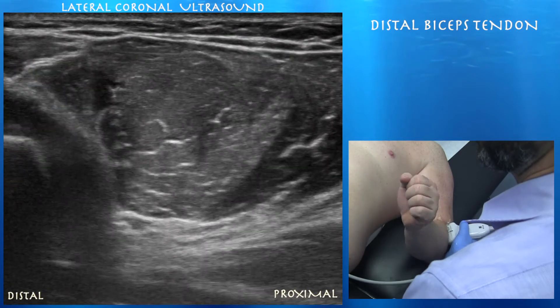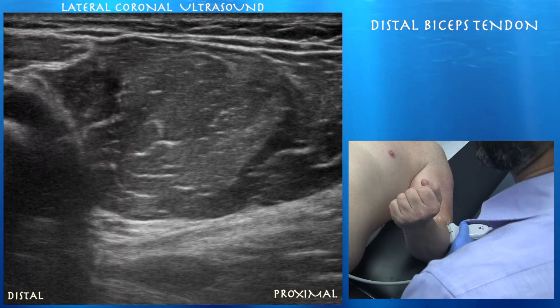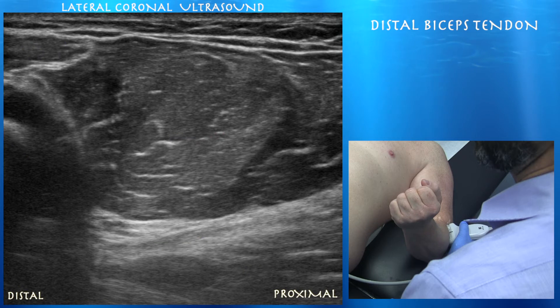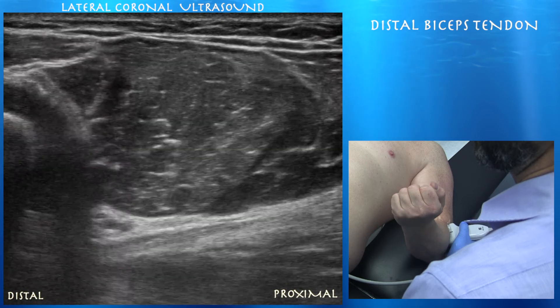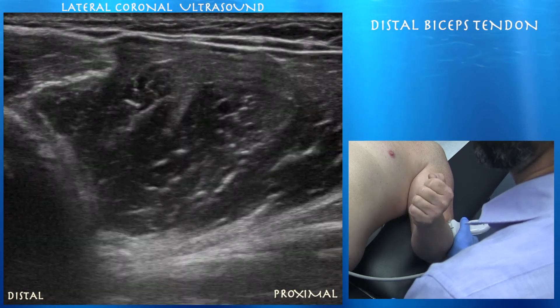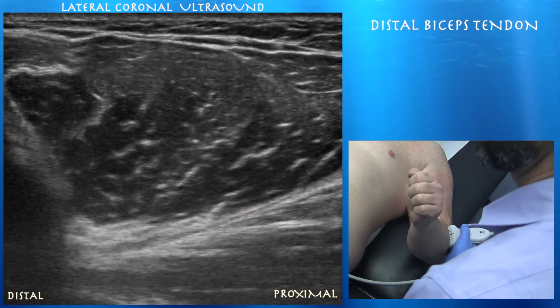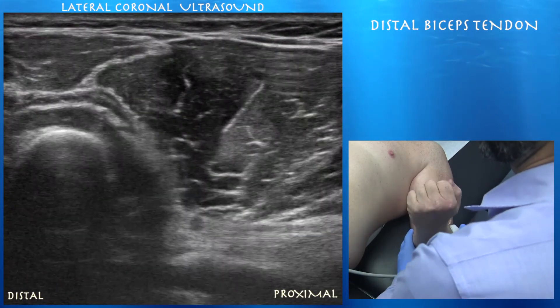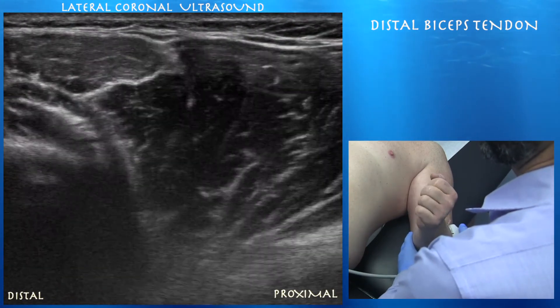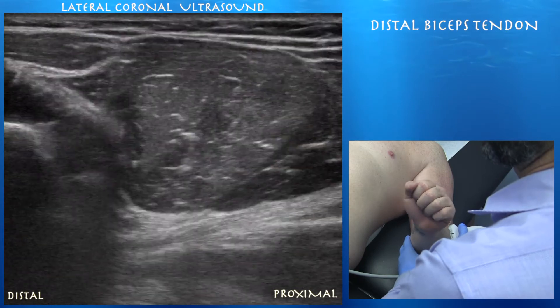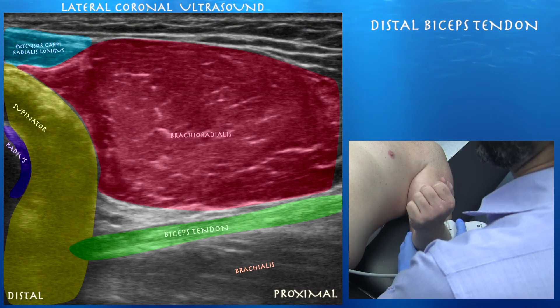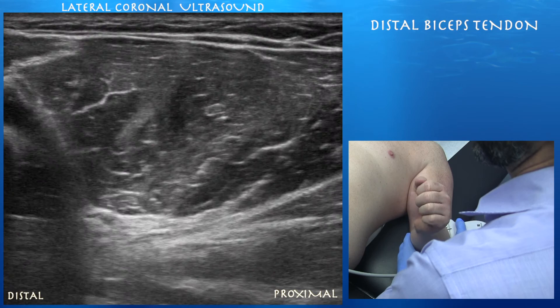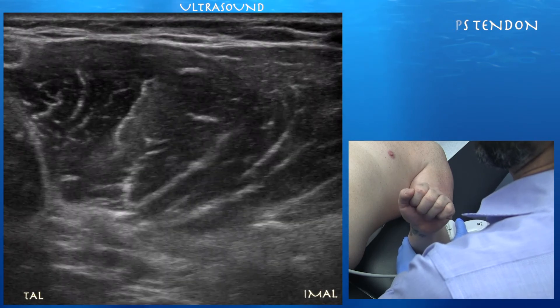Here we're doing a lateral approach and we pronate and supinate the forearm to get a good look at the radial head and the supinator muscle. You can see the biceps tendon coming across the bottom of the screen, inserting on the radial tuberosity. You can also appreciate the muscle layers — the large muscle taking up most of the screen is your brachioradialis, then you have your extensor carpi radialis longus and your supinator muscle covering the proximal radius.